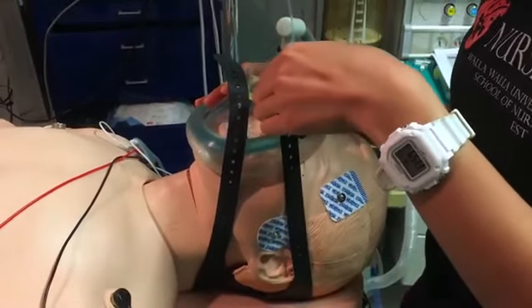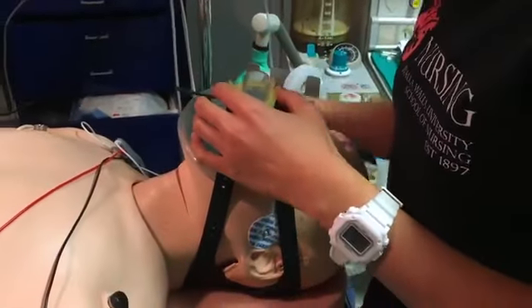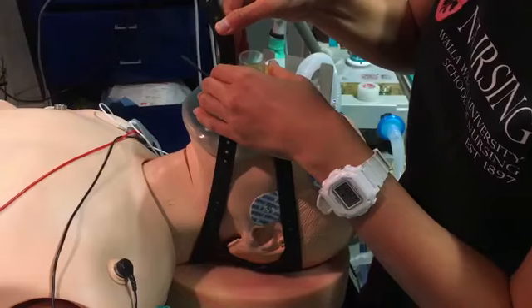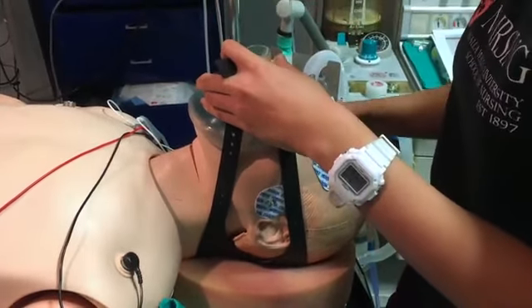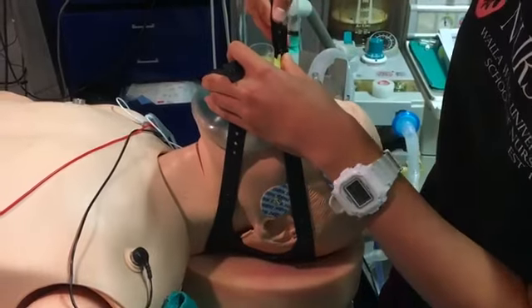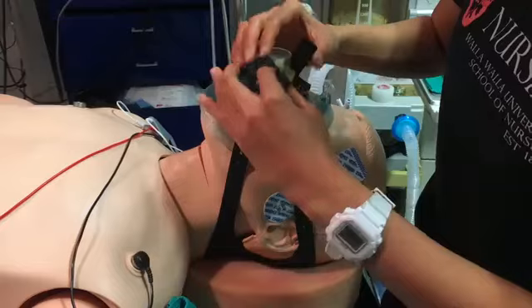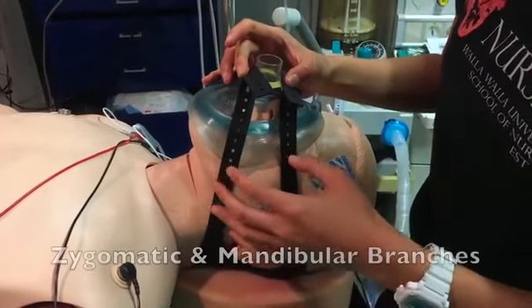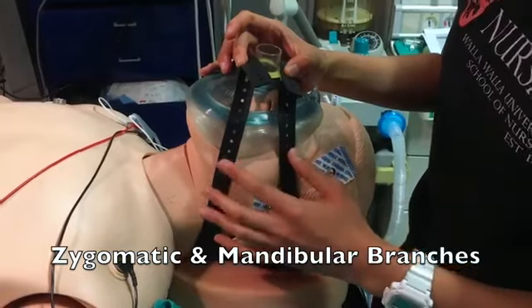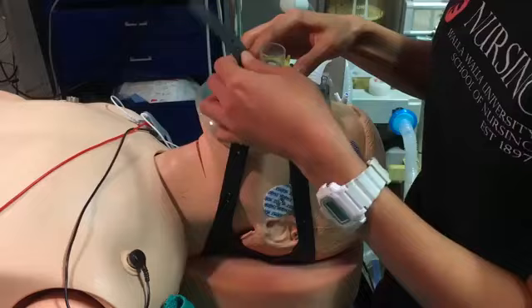They free up your hand, so if you're the only one and you have no assistance in the OR, for example, this can secure the face mask while you get your airway equipment or your drugs ready. The facial nerve branches that can be damaged with this are the zygomatic branch and the mandibular branch too. So you have to watch out for that. Don't put it too hard against the patient.